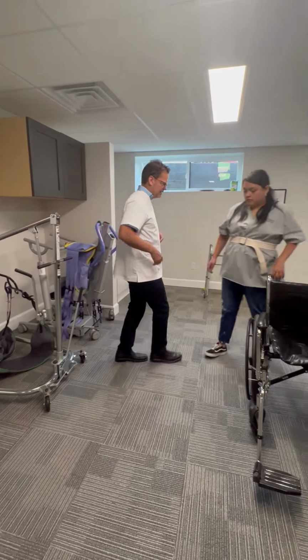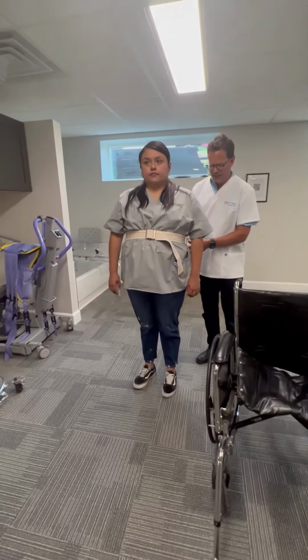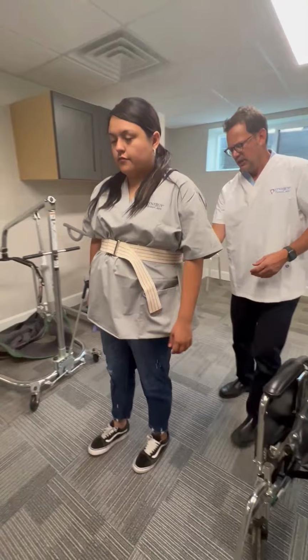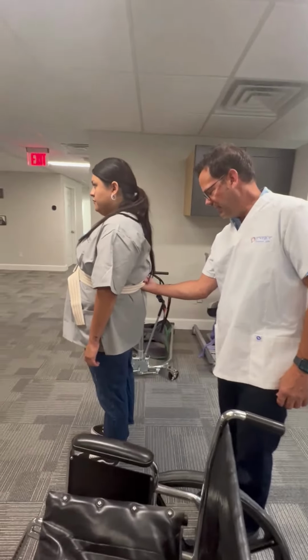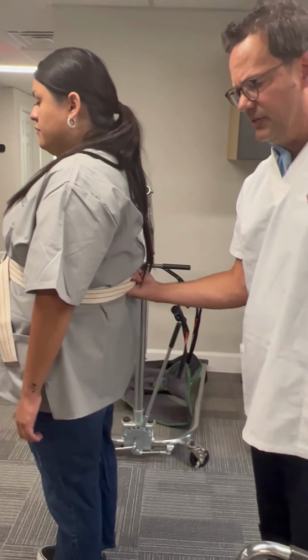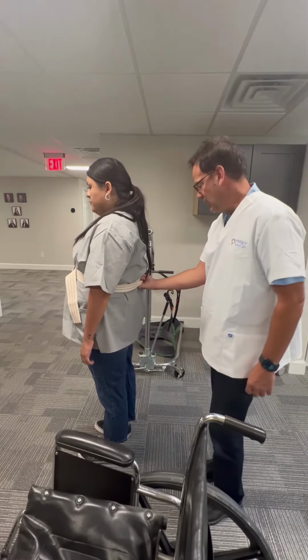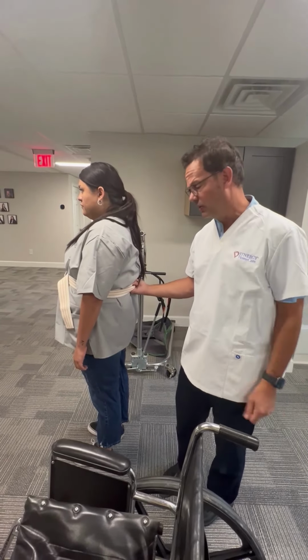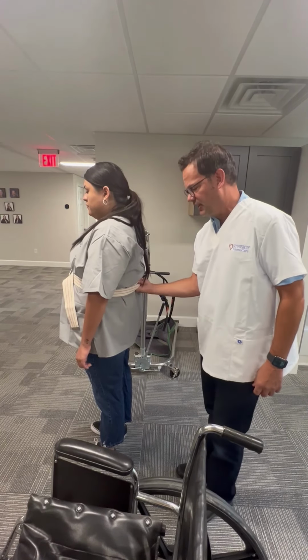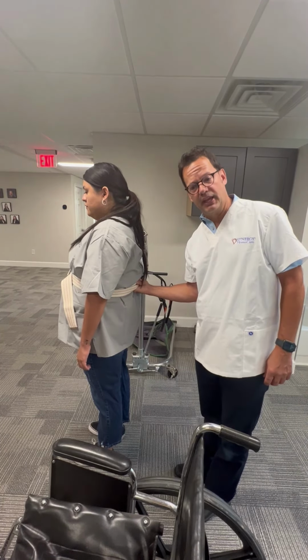So Giselle has the belt on, and I just want to show a couple of positions. If you want to step forward, Giselle. So you can see again my hand is firm on the belt. And if Giselle was walking and was a fall risk, a couple things, I might have her using a walker or a device. In this case, I'm just securing her with my hand.